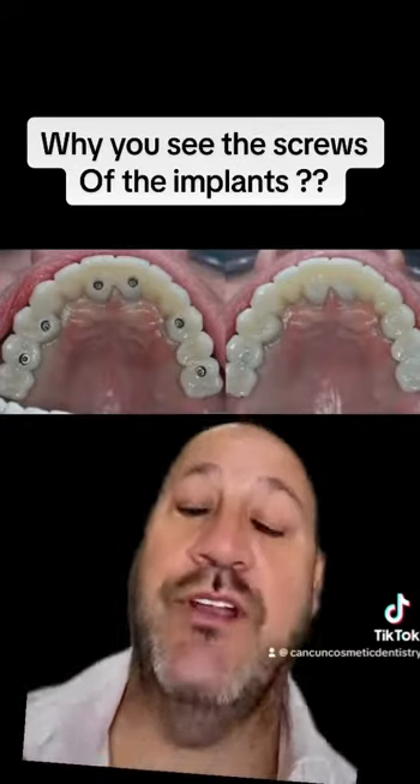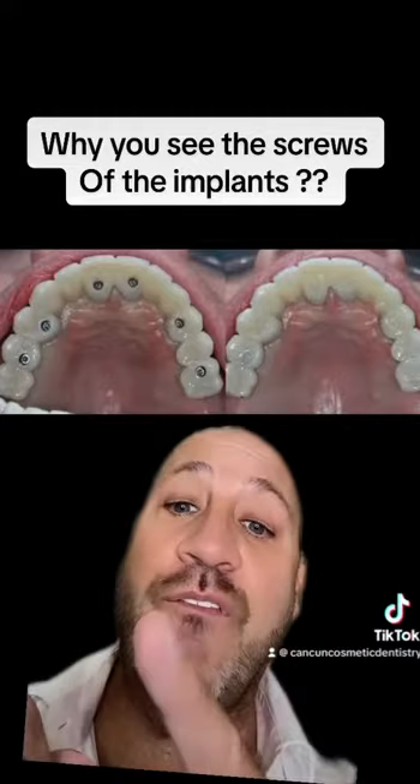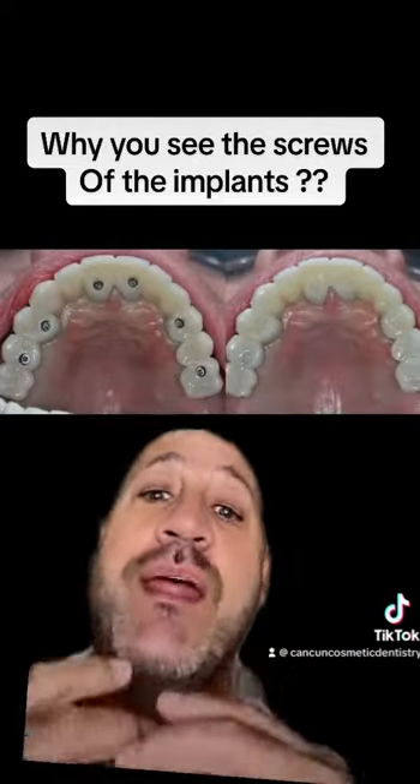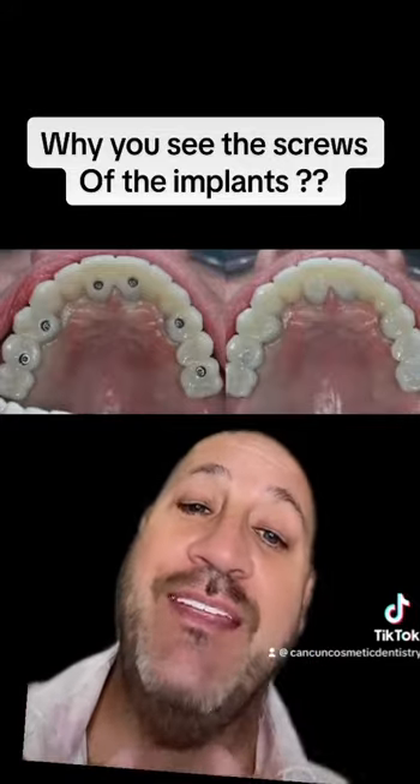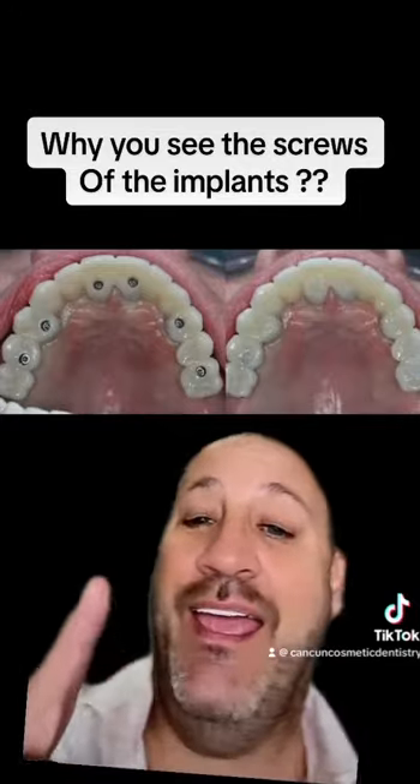Now, the big question — are you going to stay like that? No, because we covered them. We covered them with a material that is going to be looking like that. So you're going to be seeing your bridge like that, and then it could be like that.